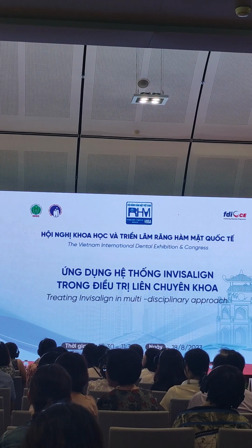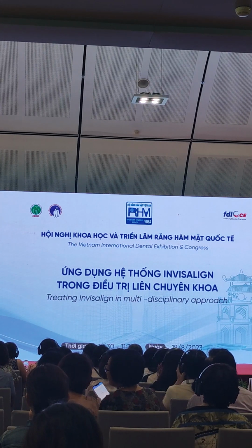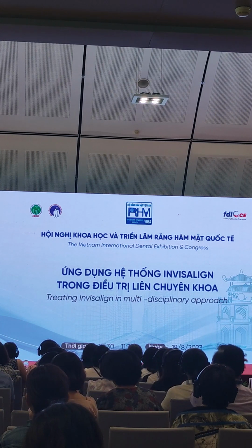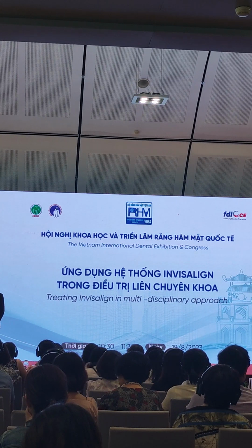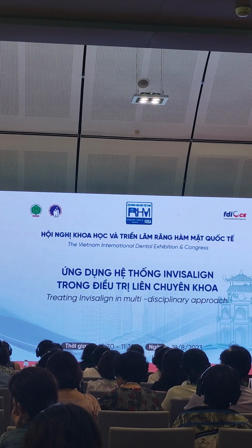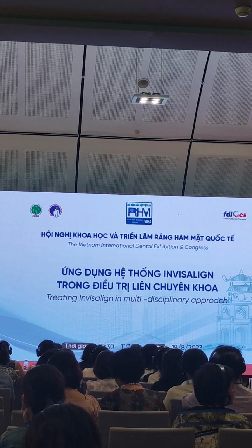Okay, thank you for the question. The first question is about intrusion. No matter whether we intrude the anterior or the posterior, do I use TADs? I never use TADs for the intrusion itself. I use TADs to control some anchorage or to recover some patients who didn't comply with wearing elastics or lost anchorage.